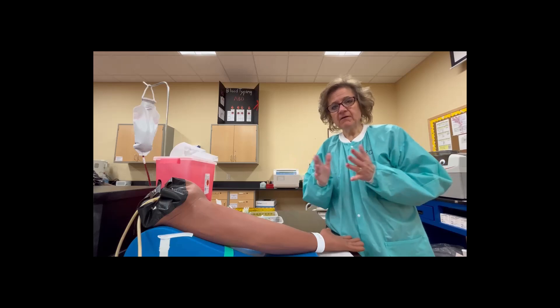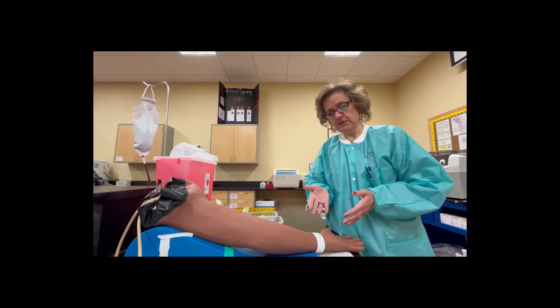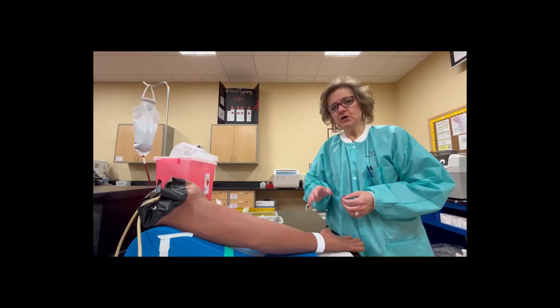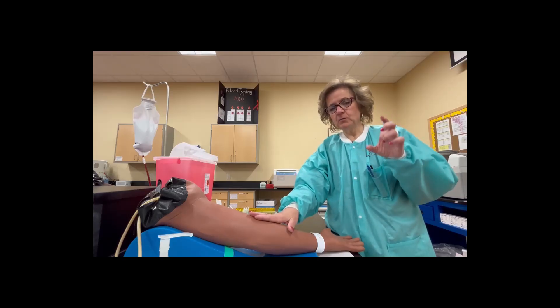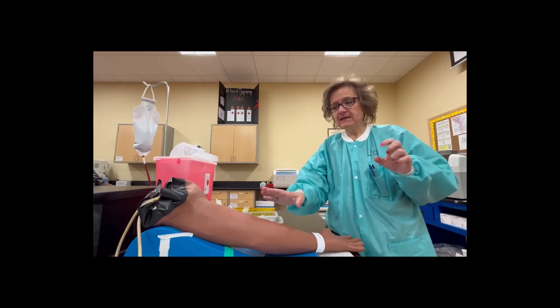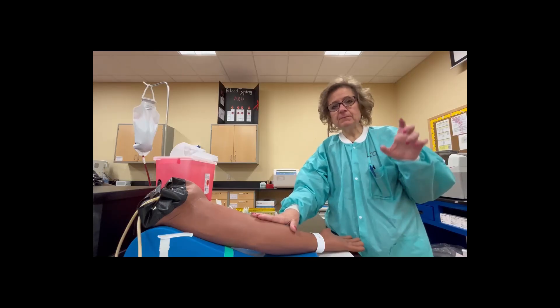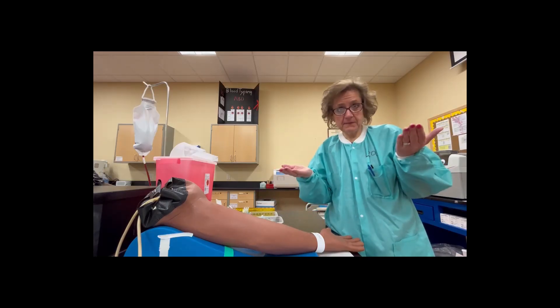The most important part of any phlebotomy is going to be your patient identification. It is vital that we make sure that the patient we draw gets put in the right tube with the right label on that tube. If I end up drawing patient A and label it patient B, I could potentially kill patient A and B in the process.